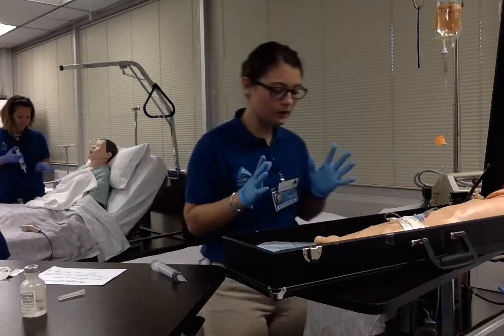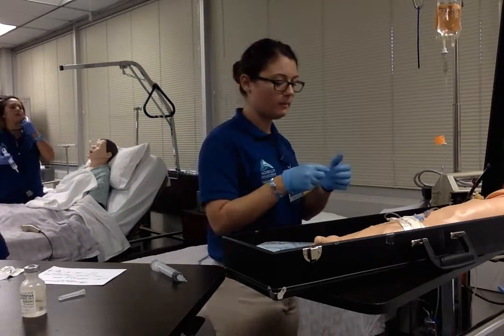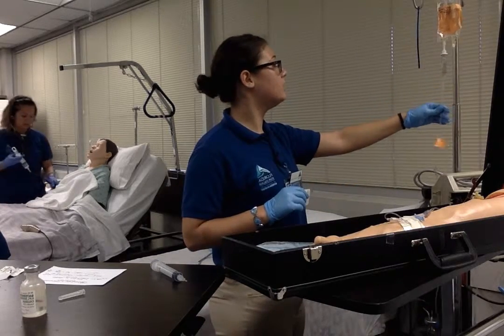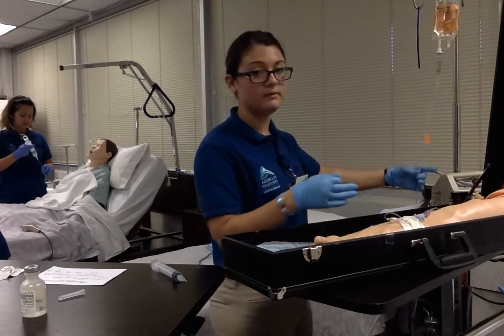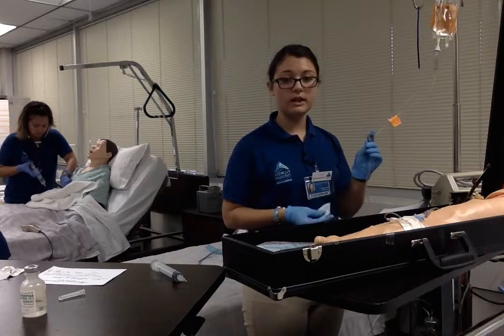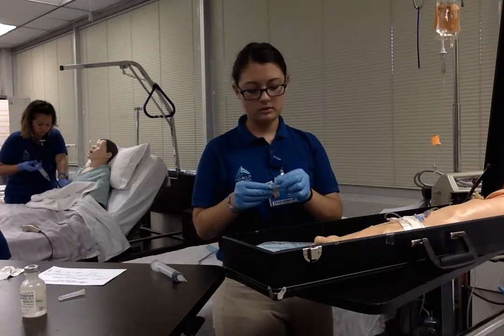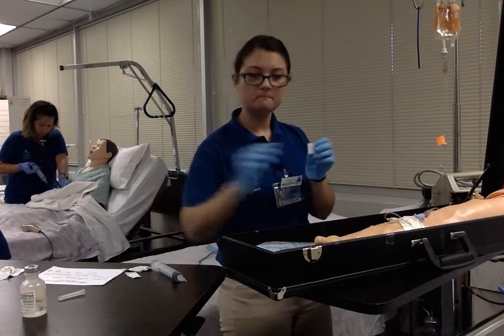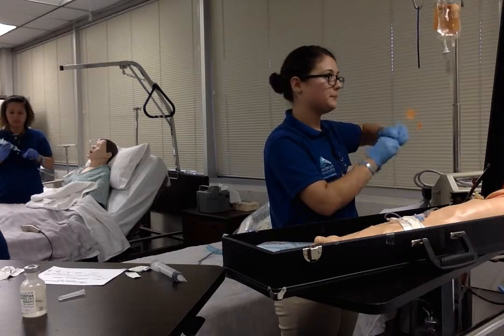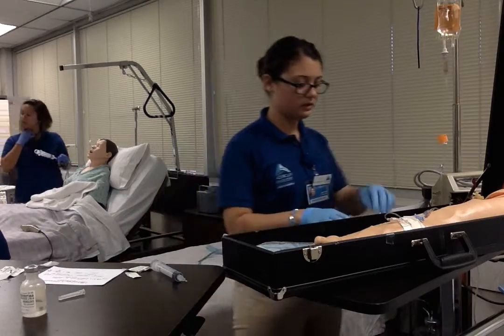So I have my gloves together, and I have my alcohol swab from the med room I brought with me, and I'm going to go ahead and establish that my line is running good, and it is, and like I said, my IV site was clean too. This is the port that we're going to be attaching the line for the piggyback in, so I'm going to go ahead and make sure that that is clean with my alcohol swab. And I was able to aspirate really good, 25 cc's. We go ahead and throw that in the trash.